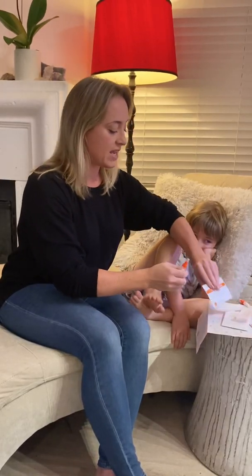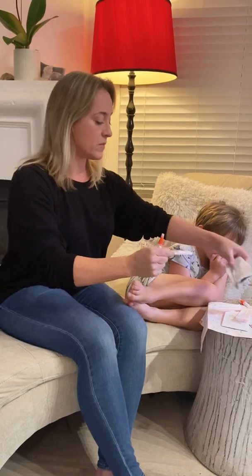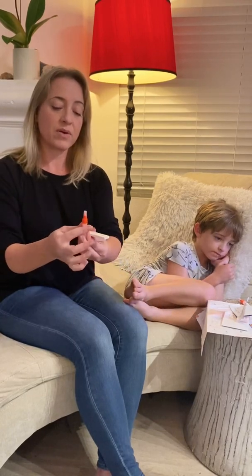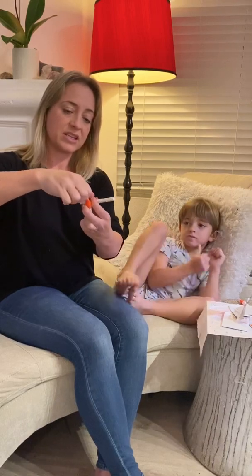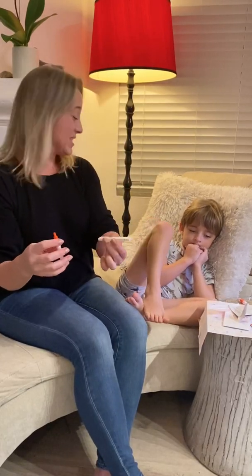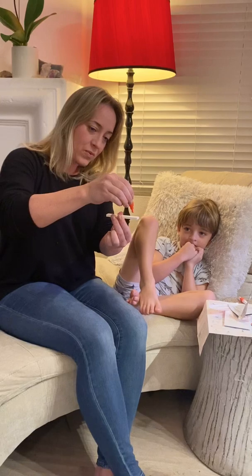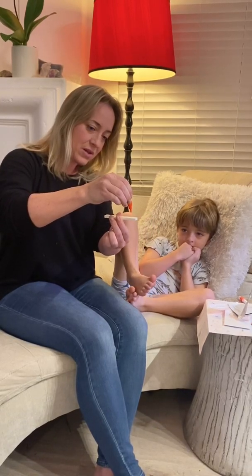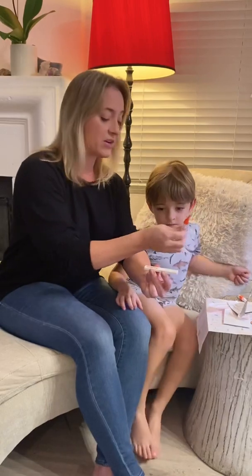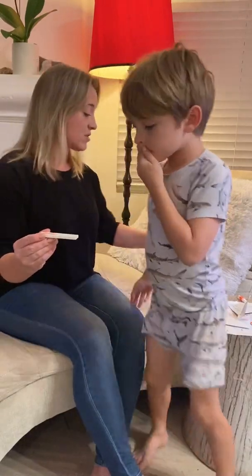We get our test card ready. Try not to touch inside either of these areas so we don't contaminate it. Open the tube that has your specimen, just the very tip. Make sure to include your kids so this is something fun and interesting for them instead of something scary. Then we do three drops: one, two, three. It may immediately start to move, but you need to give it up to 15 minutes, so we set an alarm.